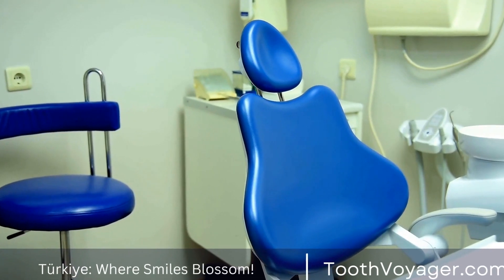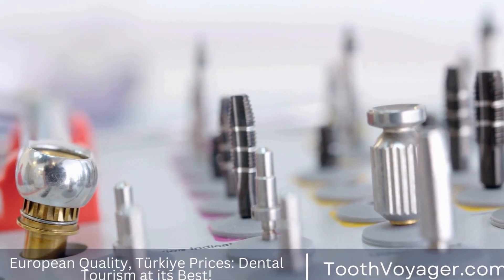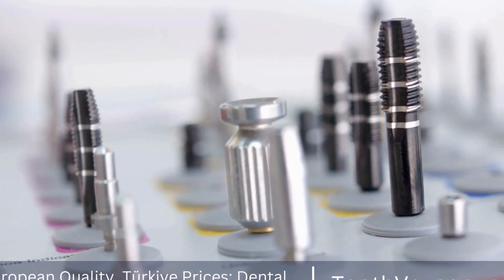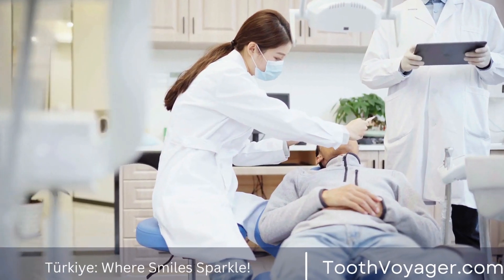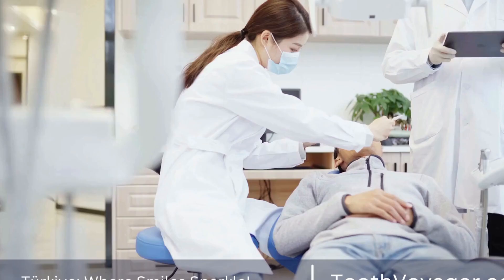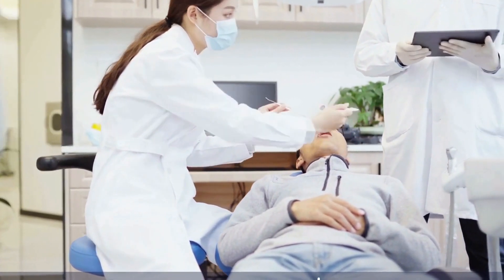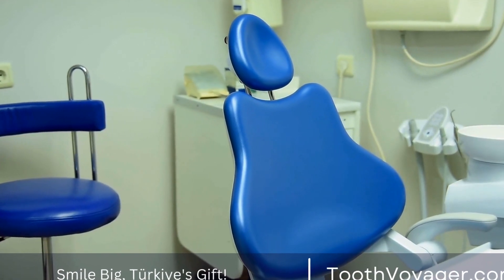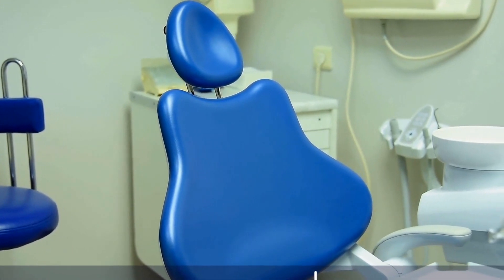The Role of Digital Dentistry in Modern Dental Procedures. In recent years, digital technology has revolutionized almost every aspect of our lives, and dentistry is no exception. Digital dentistry encompasses various technologies and tools that have transformed the way dentists diagnose, plan, and carry out dental procedures. In this video, we will explore the role of digital dentistry in modern dental procedures and how it has improved the overall patient experience.